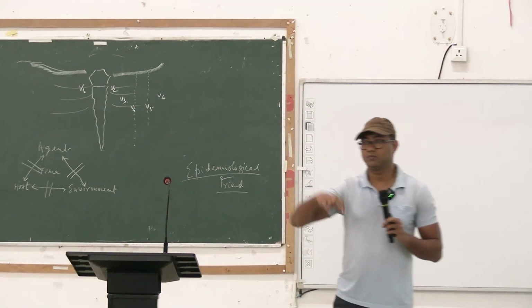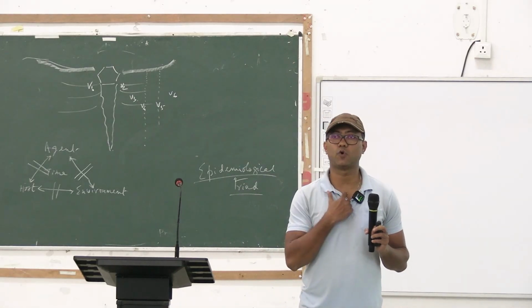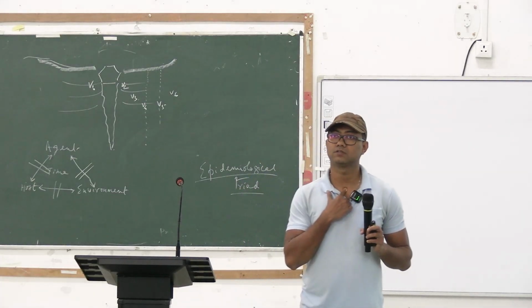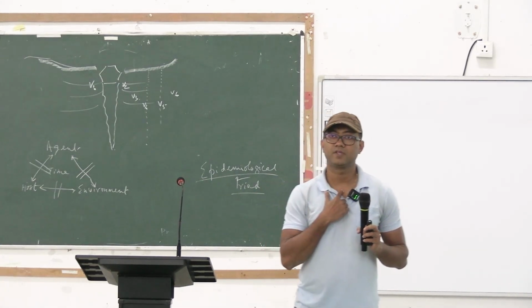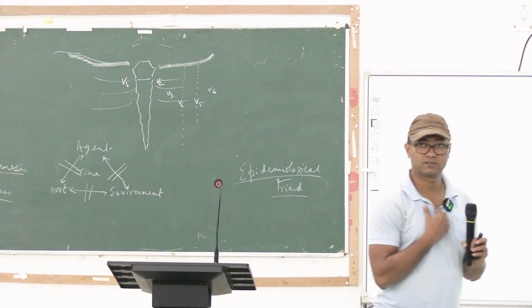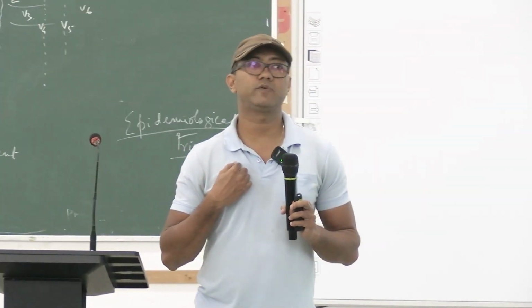So, I need to demonstrate it 3-dimensionally. If you look at me or feel your own, this is your sternal notch, the concavity, everyone getting your sternal notch? From the sternal notch you come down and you get a bony prominence, and from this bony prominence if you shift left or right, you get a space.